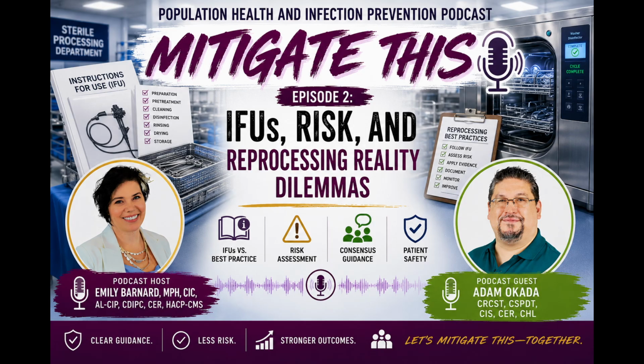So if you say, when transporting a device, it has to be in this type of container, and then you don't have that container for a tiny device, or something larger doesn't fit in that container, whatever it is, now you've opened yourself up because you're not following your own policy. And that's always a big hit with surveyors. They want to see, what is the policy for this? Can I see it? What is the step by step? So I always say, you're going to do what your hospital is actually doing for a policy, but just cite the information and make it so that your hospital can follow it easily and speak to it easily.